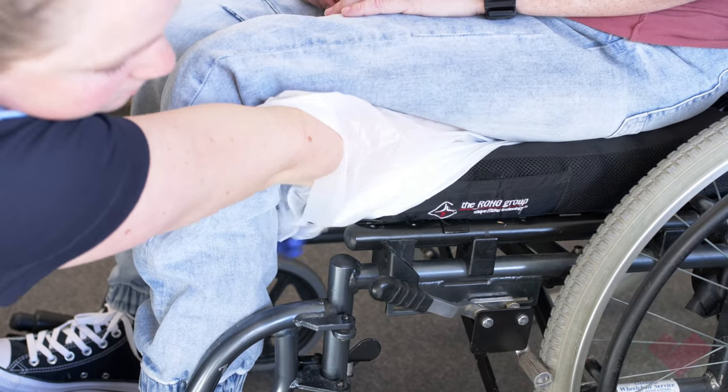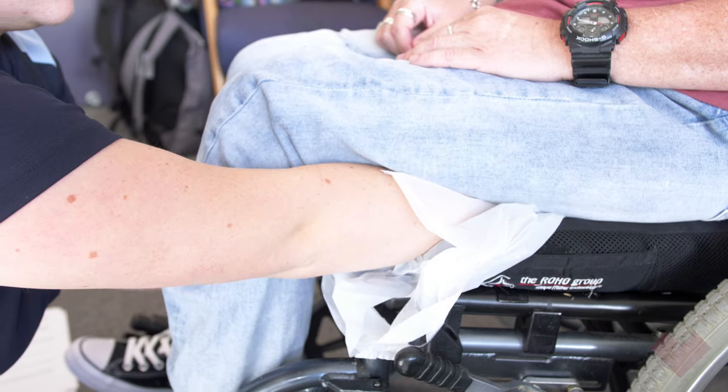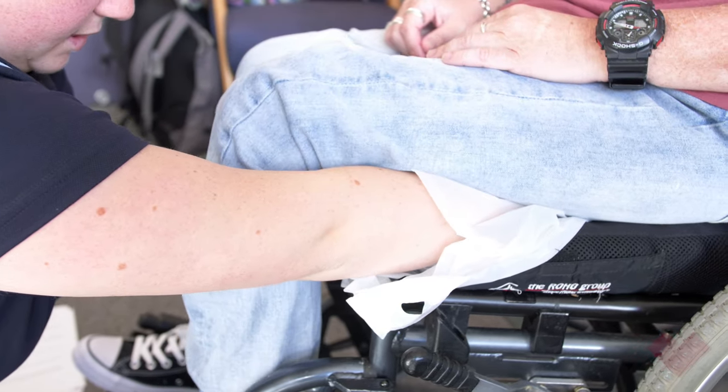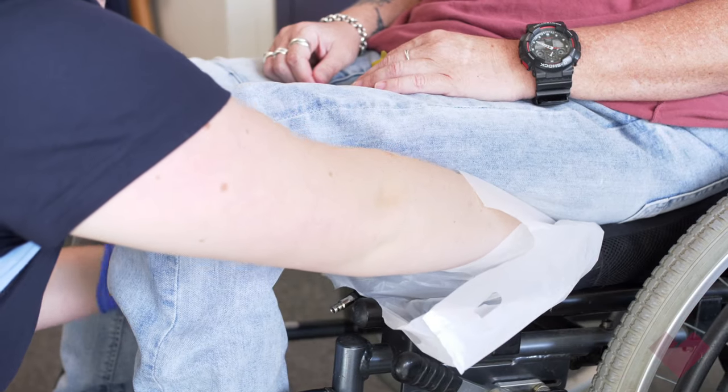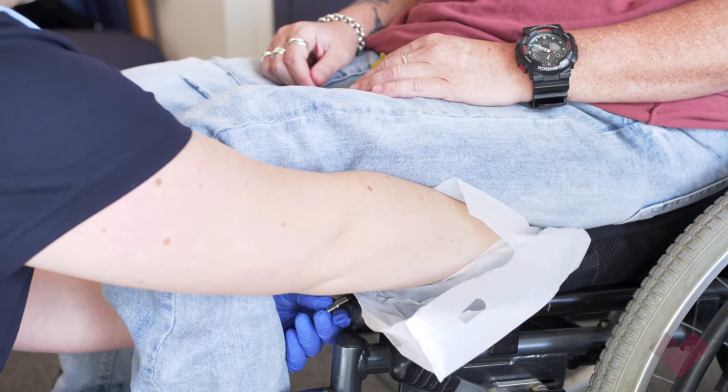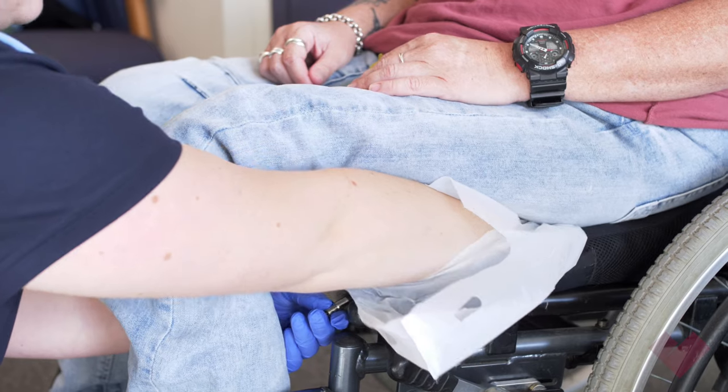If you cannot easily feel the bone, lift the person's leg slightly to feel the bone moving, then return their foot to the foot rest. Once the ischial tuberosity is located, while keeping your hand there, loosen the air valve allowing the air to escape the cushion.